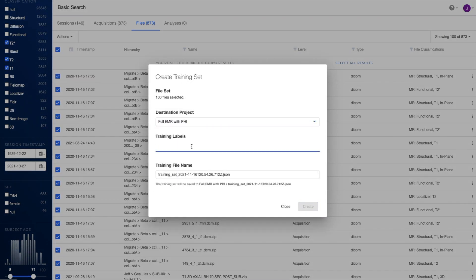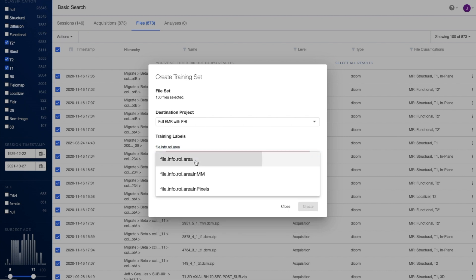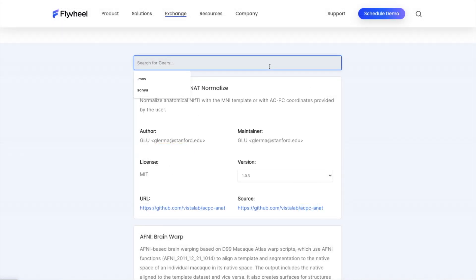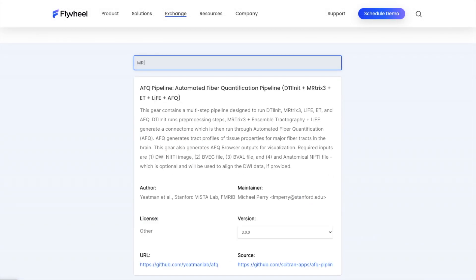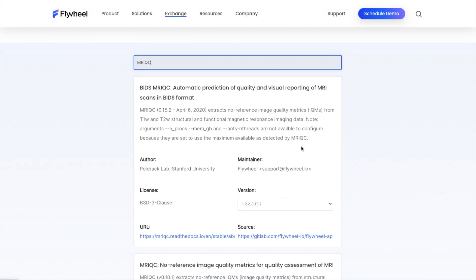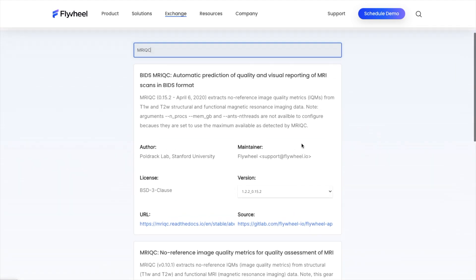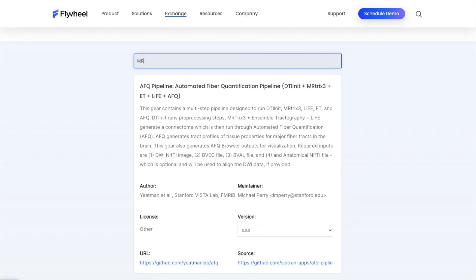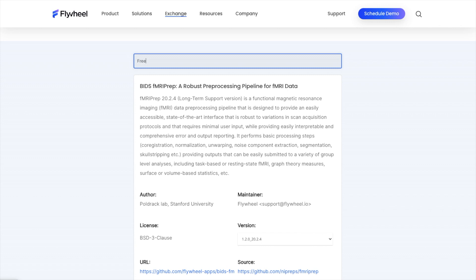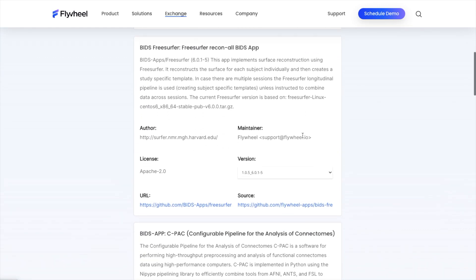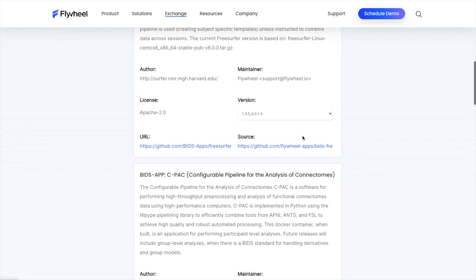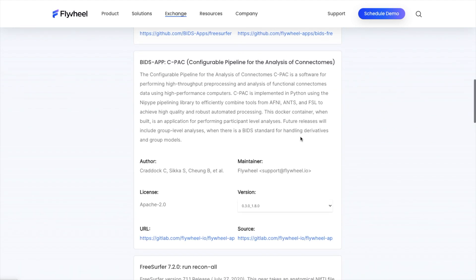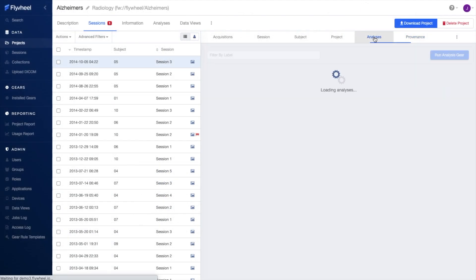These analyses and machine learning workflows can be run directly on Flywheel thanks to our on-demand elastic compute scaling and containerized application plugins called Gears. Our Gear Exchange offers over 70 pre-built Gears that do everything from automate routine tasks such as metadata extraction, classification, and quality assurance to full analytic pipelines. You can also create and upload your own custom Gears for use by you and your research team.